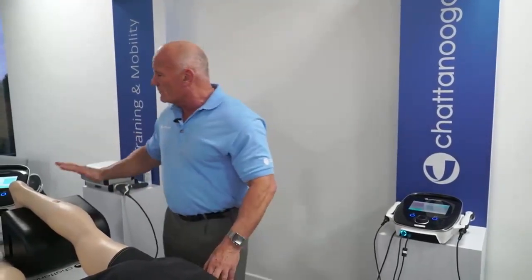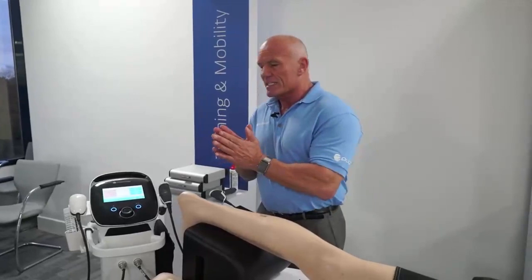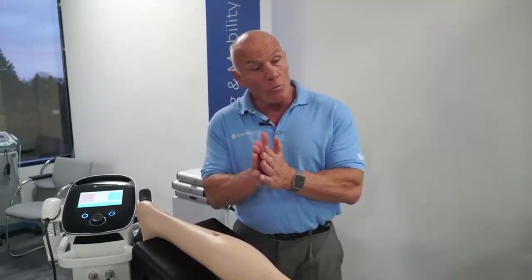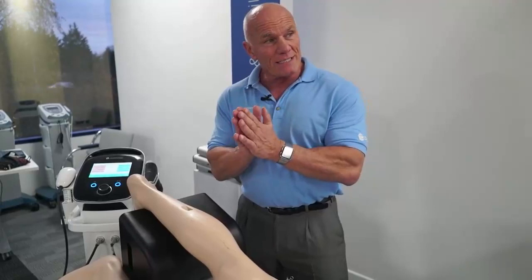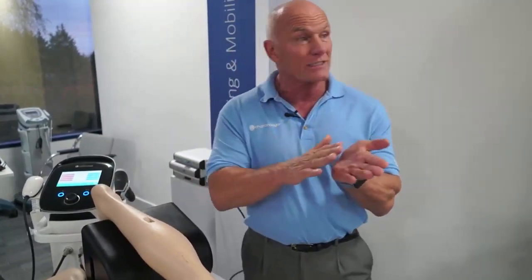So what we've got here now is the new comfort mode. And it starts at a tenth of the value that I've entered on the machine. So if I want to attain 4 bar, it automatically starts at 0.4 bar. And it's defaulted as on, because it's that important. So it's going to start at 0.4 bar, which is like this. Patient likes that.